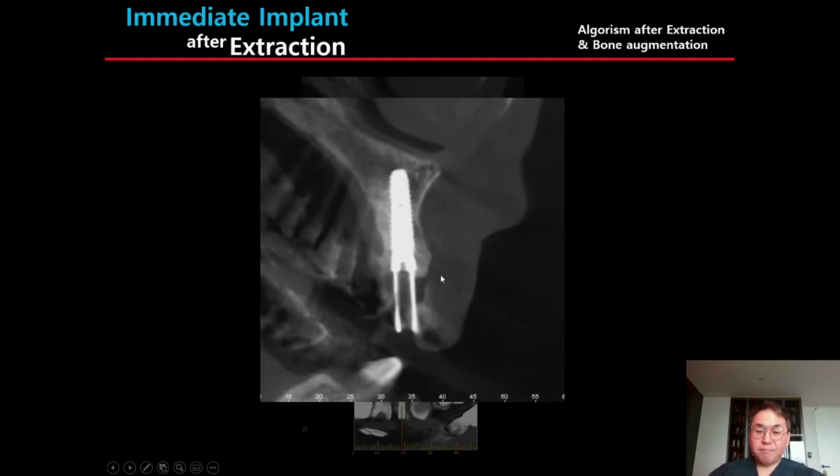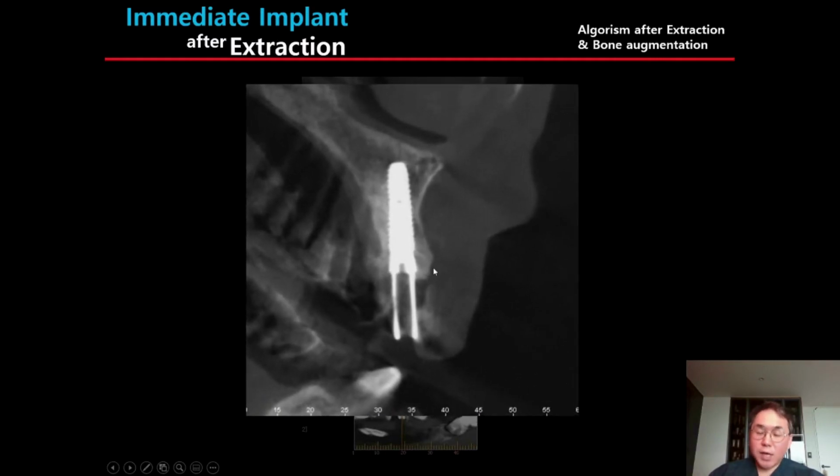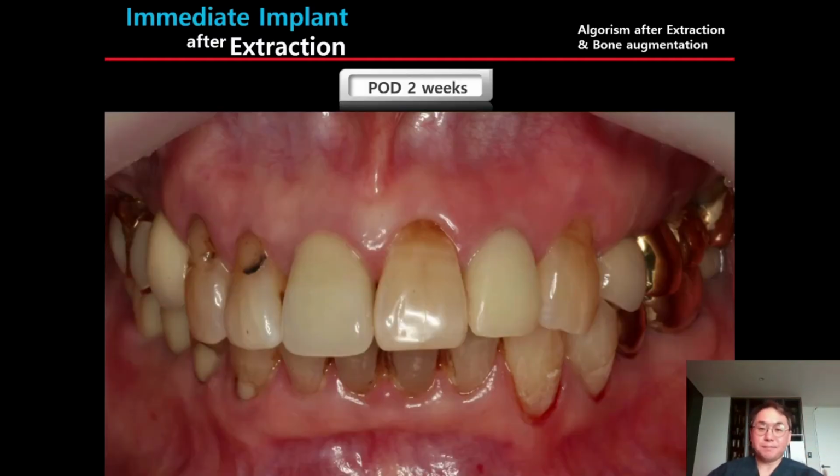Can you see? This is a xenogenic, low temperature treated xenogenic bone graft material. This is the pre-existing labial bone top, but I packed the bone to the top of soft tissue. Let's see the longevity of this graft material. Even though this graft material was not placed within the bone, this bone graft material could be maintained because this graft material has biocompatibility. Let's see the long-term follow-up.